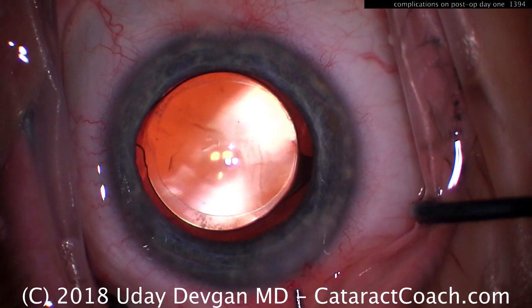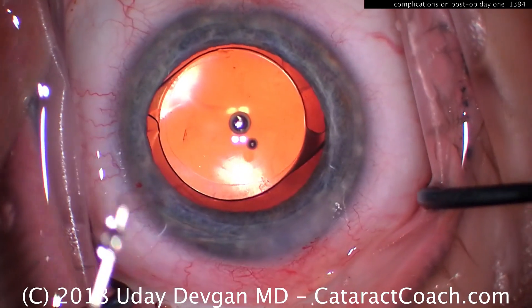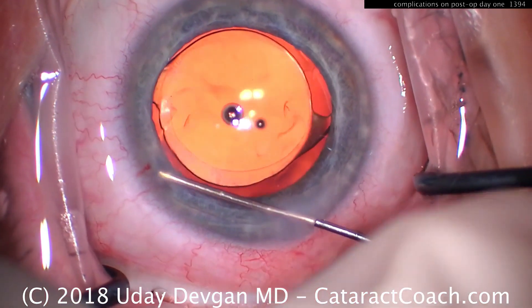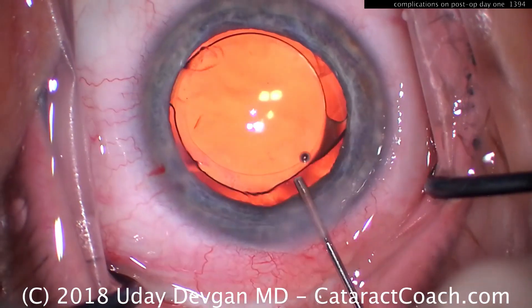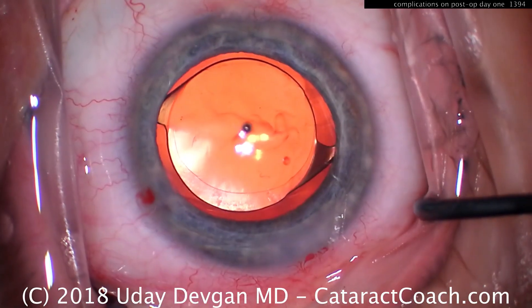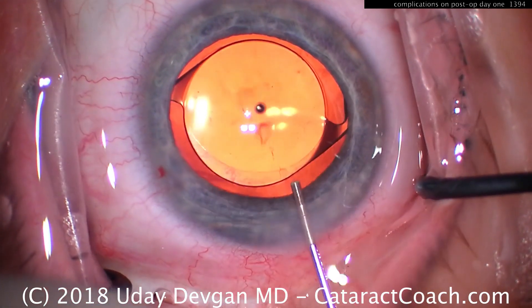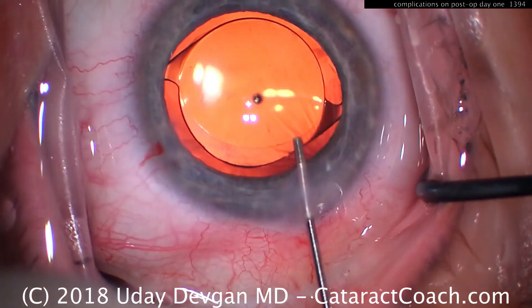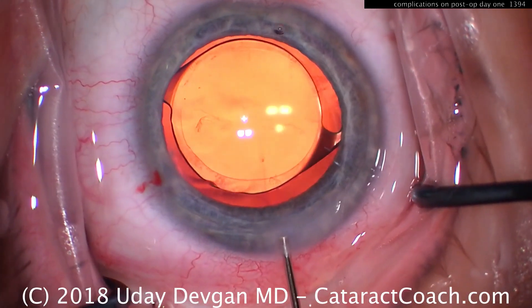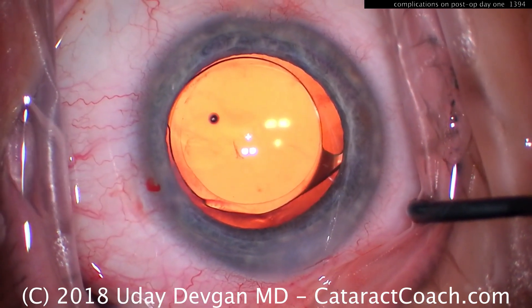Without the angle sweep, oh my goodness — that's a lot of viscoelastic that came out of the eye. Watch: there's a tremendous amount of retained viscoelastic still present. This is a good example of why I like to sweep that angle at the end of every case. High pressure on post-op day one is not from a steroid response — it's from retained viscoelastic clogging up the trabecular meshwork, causing IOP to spike so high.